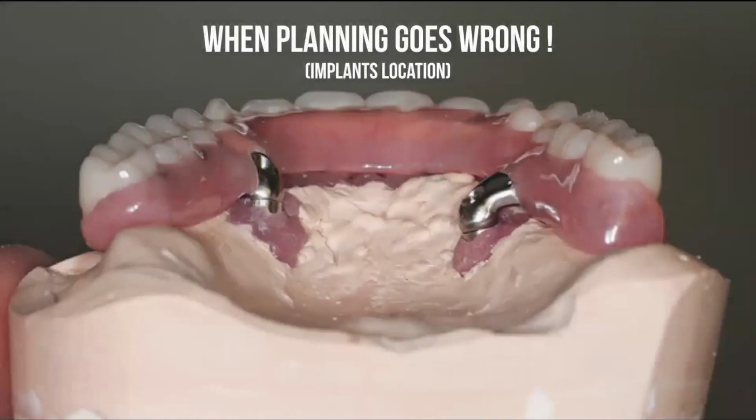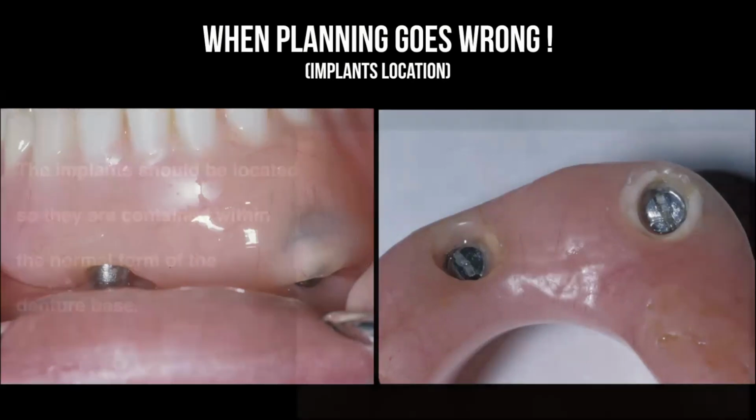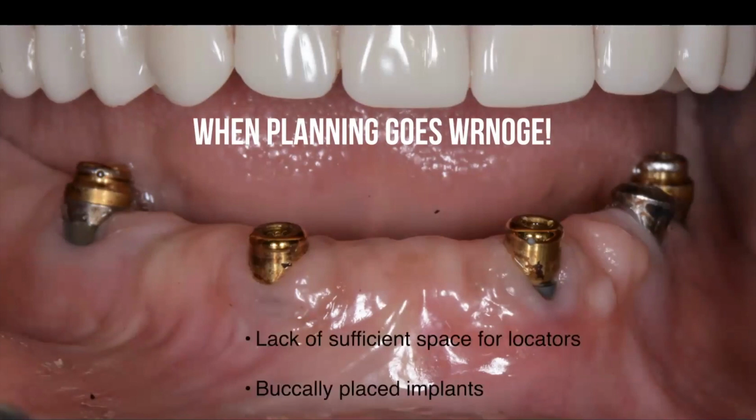If you don't follow the surgical guides, the implants can be placed off, and that's where outside-the-box thinking comes in. If you're not within the ridge, or you don't have enough bone or keratinized tissue, that's how we're going to deal with it. We don't want to see these cases in your practice, when patients don't have enough restorative space or the implants are placed wrongly, so they all come in and you have to deal with it.